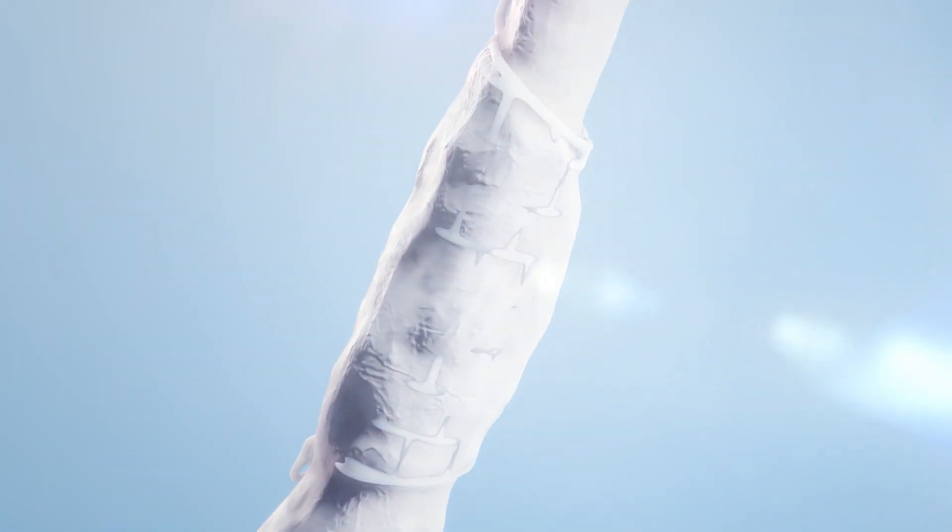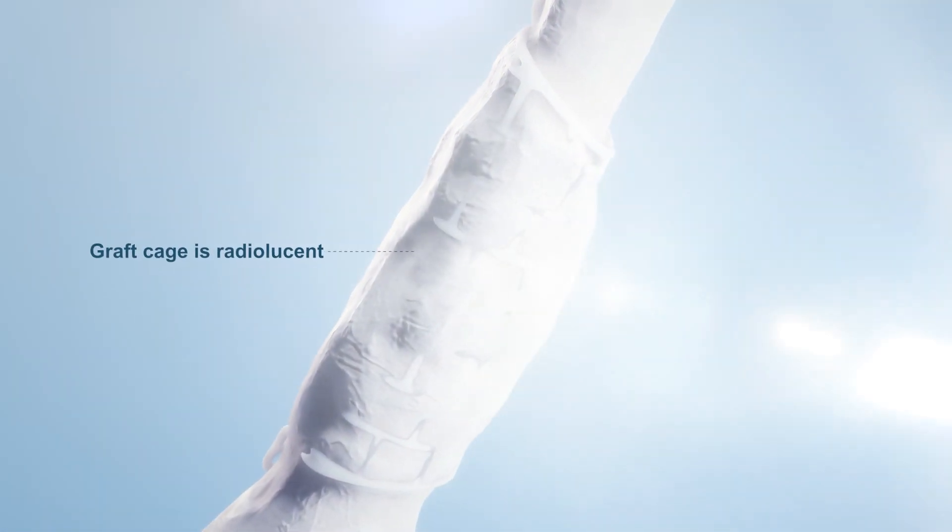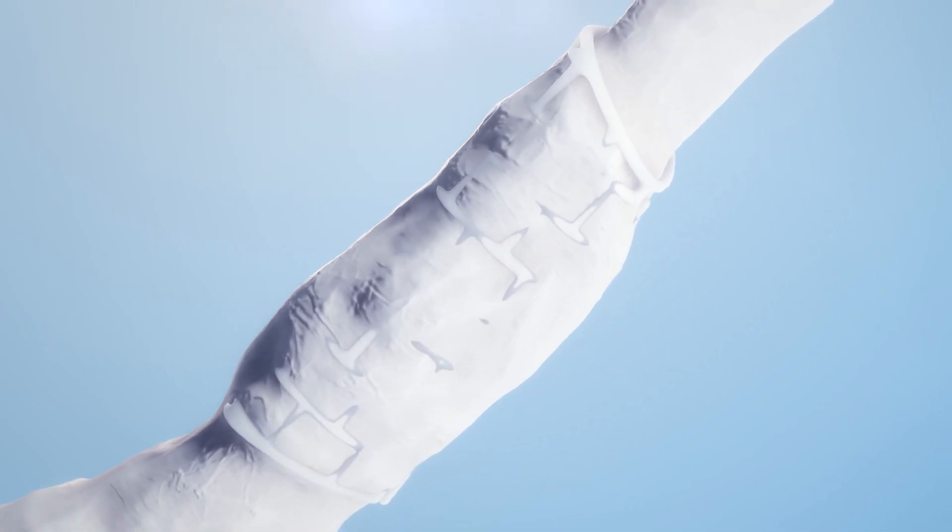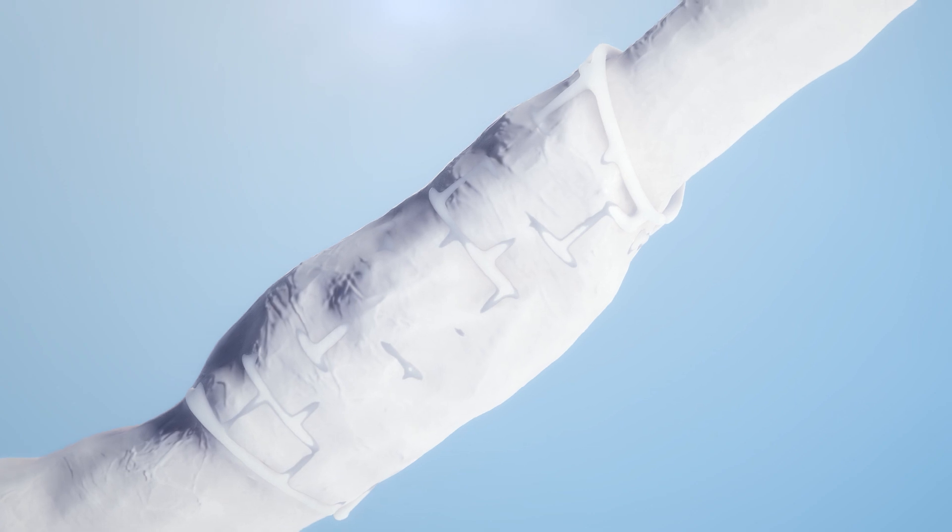The graft cage device is radiolucent, which allows the patient's recovery process to be easily monitored, as opposed to a radiopaque titanium cage that restricts evaluation of the healing.